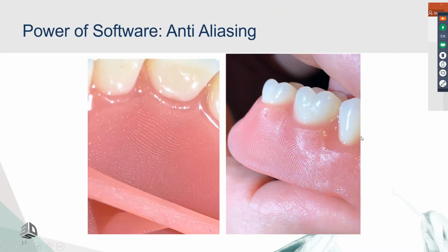And the last topic is anti-aliasing. So I don't need you guys to remember the name of anti-aliasing, but I want you to be able to identify from the surface of something that you're looking at, a printed part, if you're shopping for a printer or if you're inspecting your parts, do you see all the pixels, okay? This is the strength of a software team, an amazing software team. Without distorting or washing out any of the detail, are they able to give you a smooth surface?